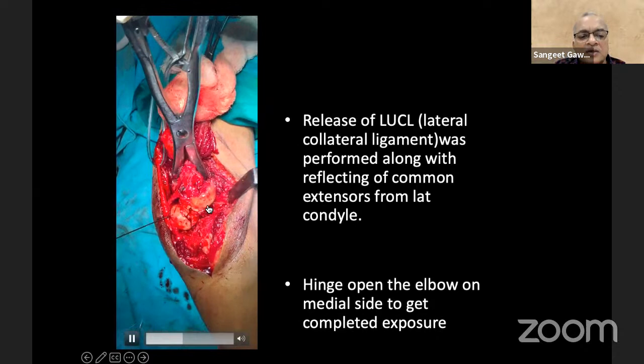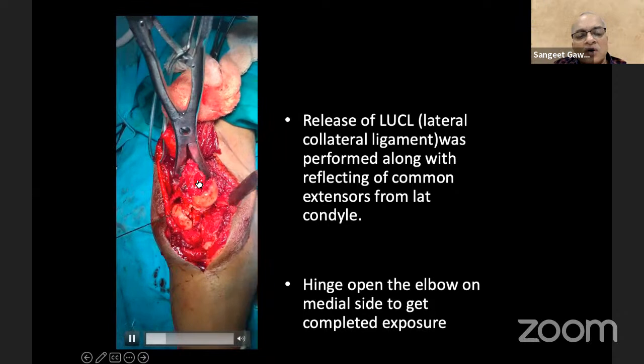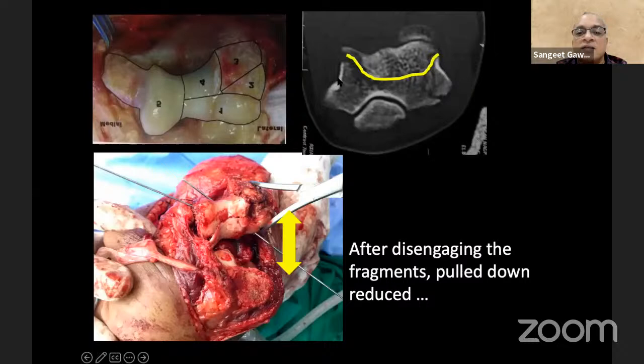We have done an olecranon osteotomy, and through the posterior approach, we can work on or rotate the humerus and then see what is happening anteriorly. So this is how it was done. This was the fracture which had migrated superiorly. It was brought back by careful dissection, releasing the soft tissue, the fibrous tissue. And this is how the trochlea was first reconstructed. On your left is the ulnar nerve.